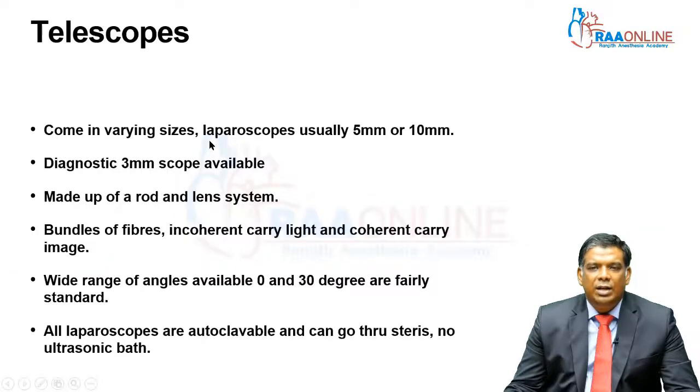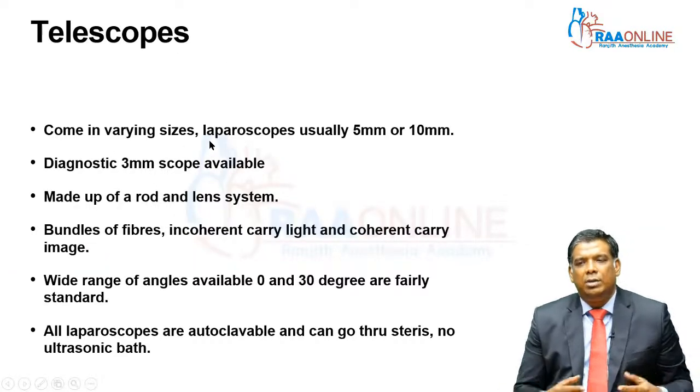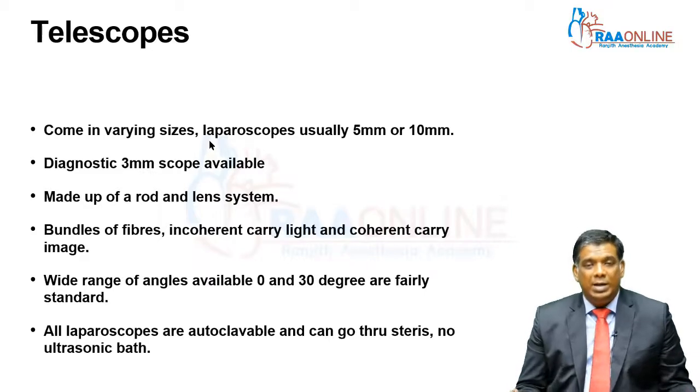So these come in varying sizes. They are usually 5 to 10 mm, as I told you earlier. A diagnostic 3 mm scope is present, very little used by general surgeons, but mostly by pediatric surgeons.